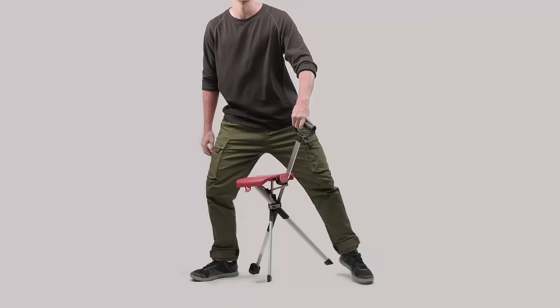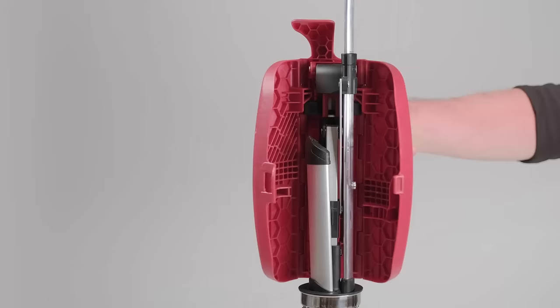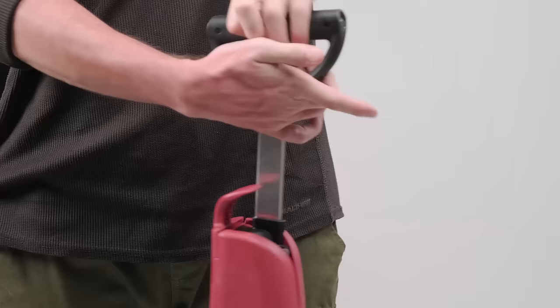Packing up is a snap. Pull the switch grip upward until the legs are back in original position and re-clip the seat lock. There's even a nifty handle hook for easy transport and storage. Ta-da!